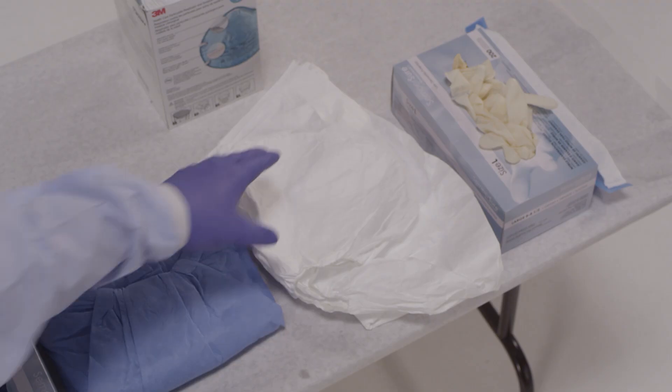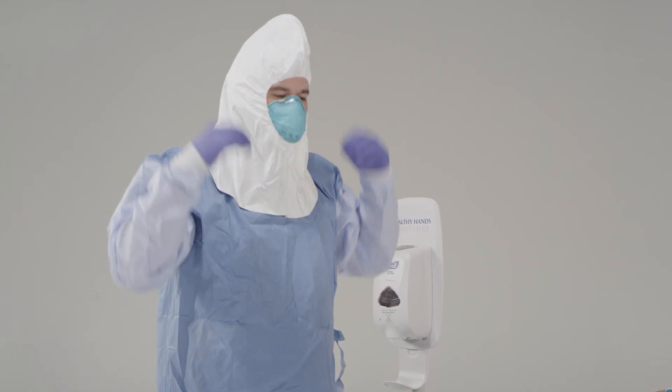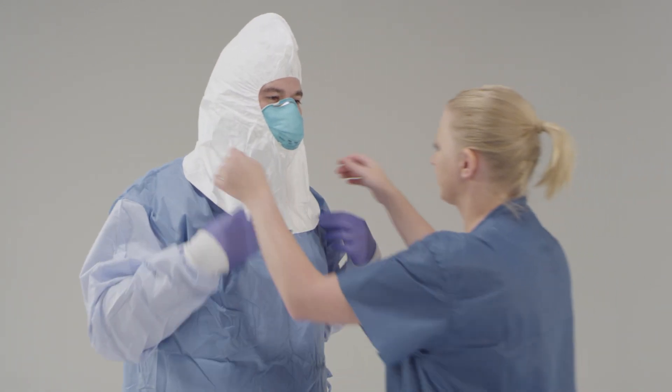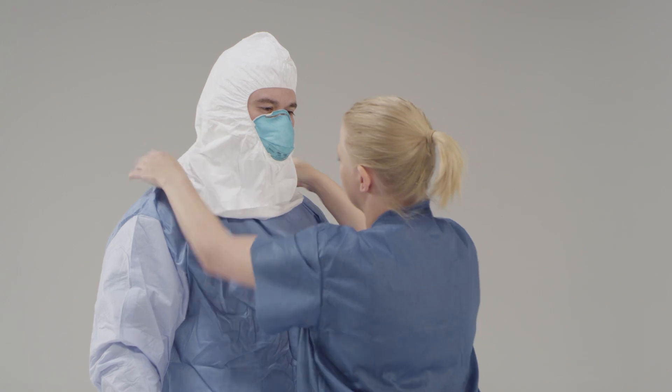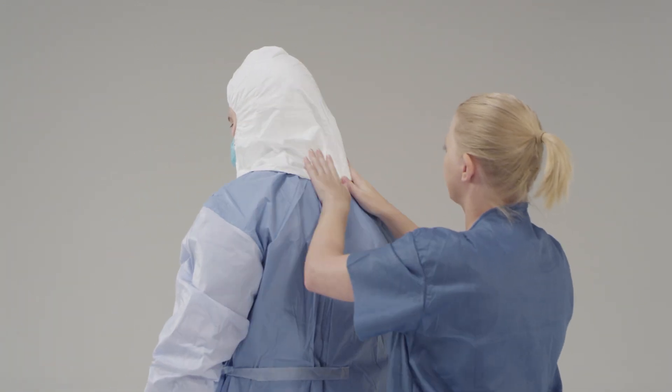Now put on your surgical hood. First you need to inspect it. Put on the surgical hood so that the opening is in the front. Slowly pull the hood over your head and your shoulders. The trained observer should give a check once the hood is in place to ensure that all parts of the skin are covered, no hair is hanging down, and the hood extends to the shoulders. If the patient is vomiting or has diarrhea, put on a single-use, fluid-resistant or impermeable apron that covers the torso to the level of the mid-calf, providing an additional layer of protection against exposure to body fluids.